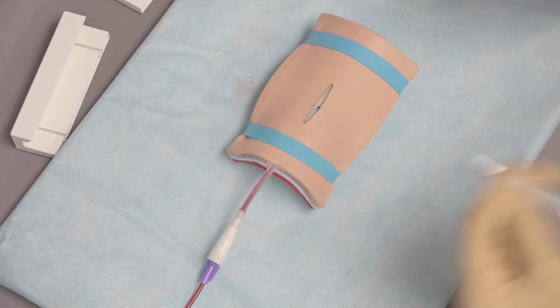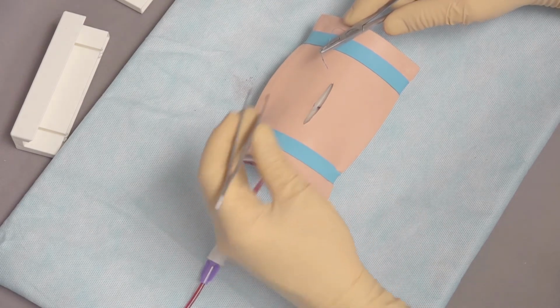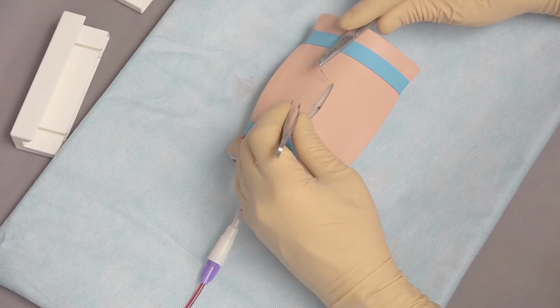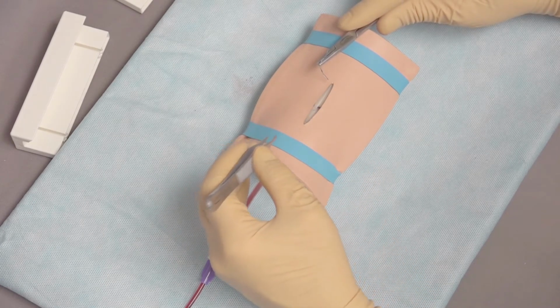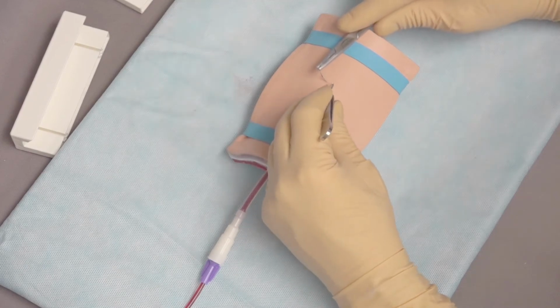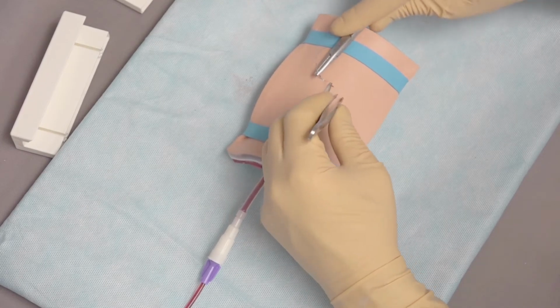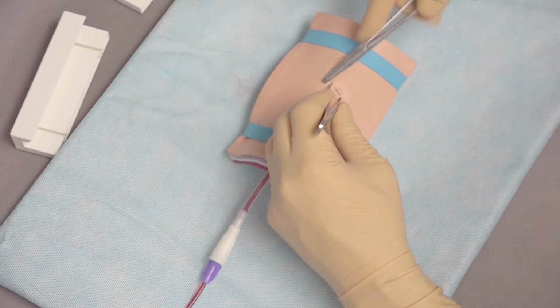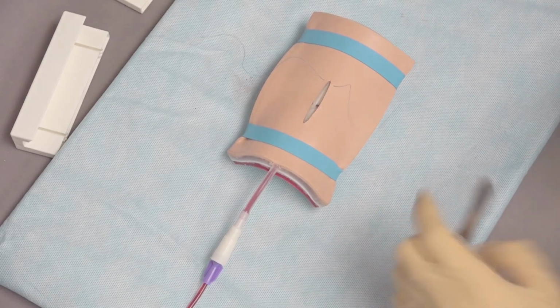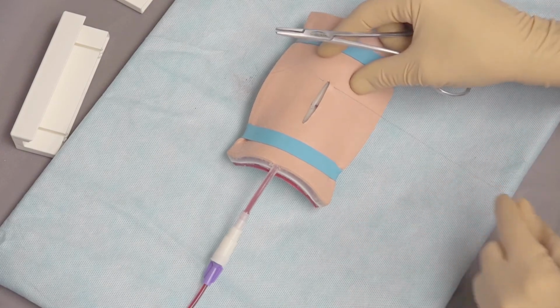In this case, we've gone just through the skin, and we're going to start at the right side of the incision because I'm a right-handed surgeon, and work our way to the left. If I were a left-handed surgeon, I would work from the left and go to the right. So we always want to work from our dominant hand to our non-dominant hand. In this case, we're going to go ahead and start a continuous pattern, making sure that we get around 3 to 4 millimeters from the cut edge of the incision.